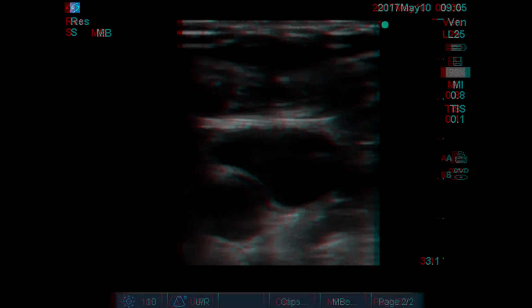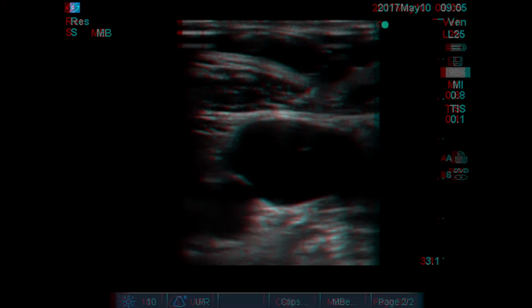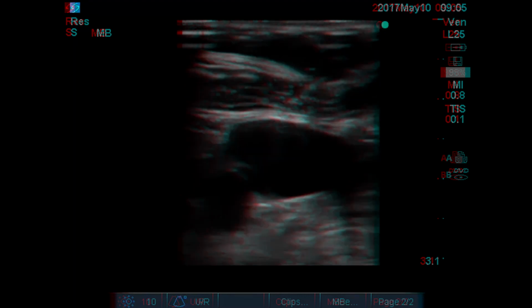Here, before I take the needle to cannulate the IJ, I confirm with ultrasound that we're in the precise place that we want to be for an insertion site compared to where the anatomy lines up in the optimal position.